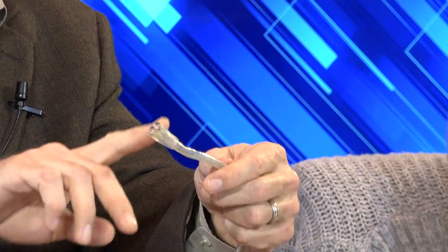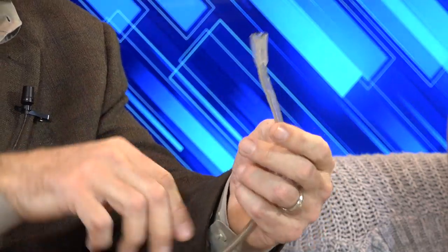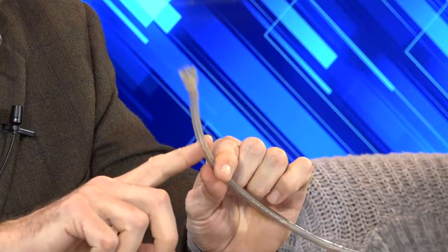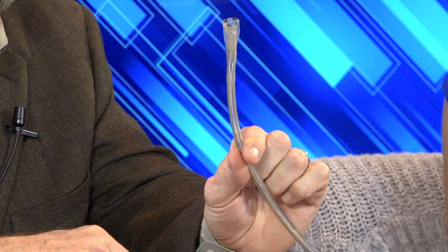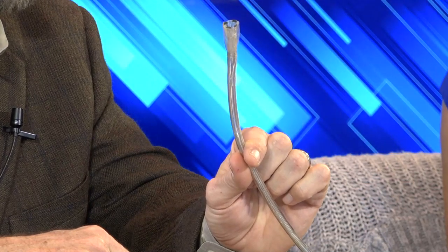At any rate, we had a balloon on the end. We did have up to a 20-degree angle that we offered before, and a stainless steel coil reinforced cannula. Now, some of the challenges that we saw, and Joe's going to blow this up with air. I'm going to let Tammy do it. Tammy's going to blow this up with air.